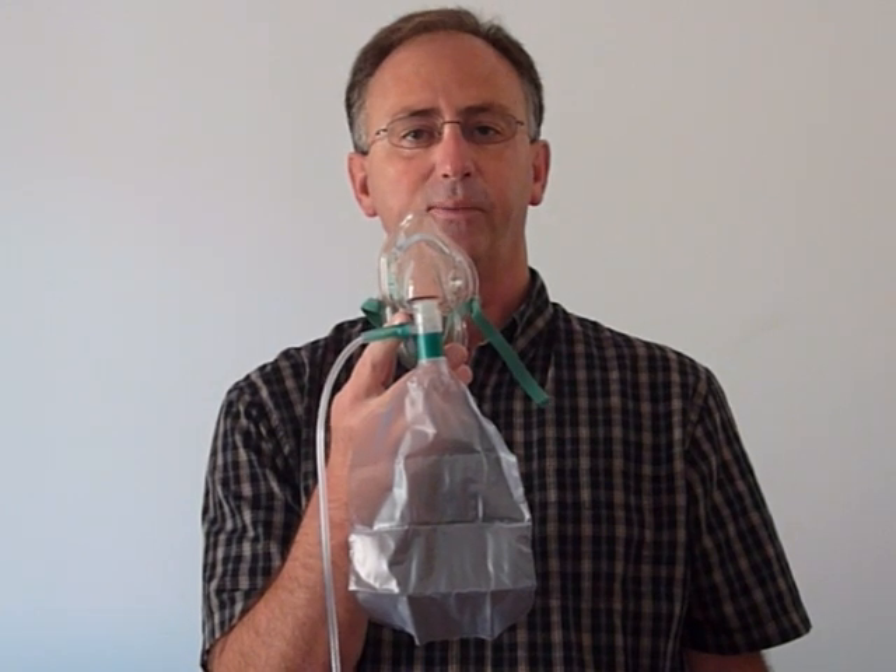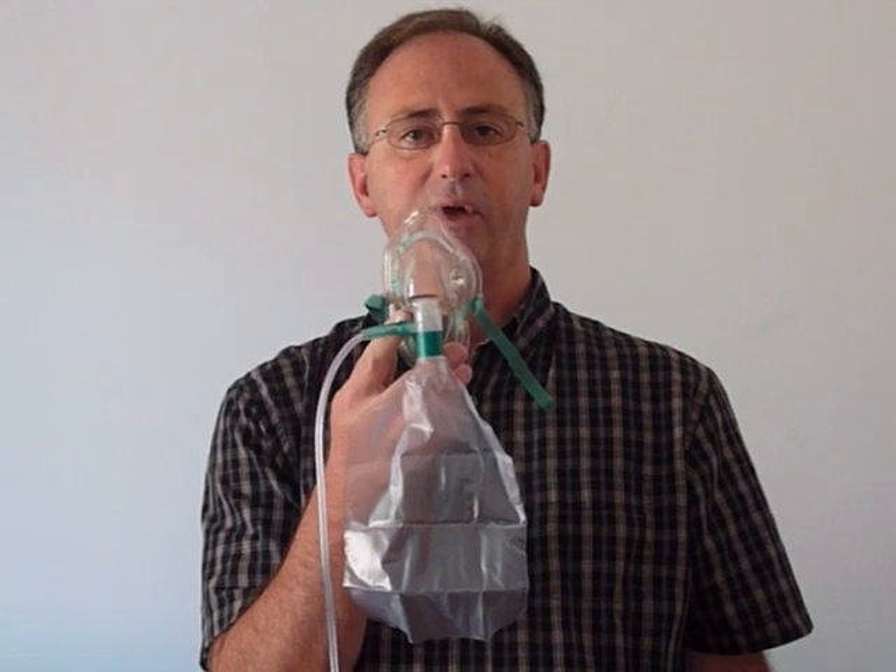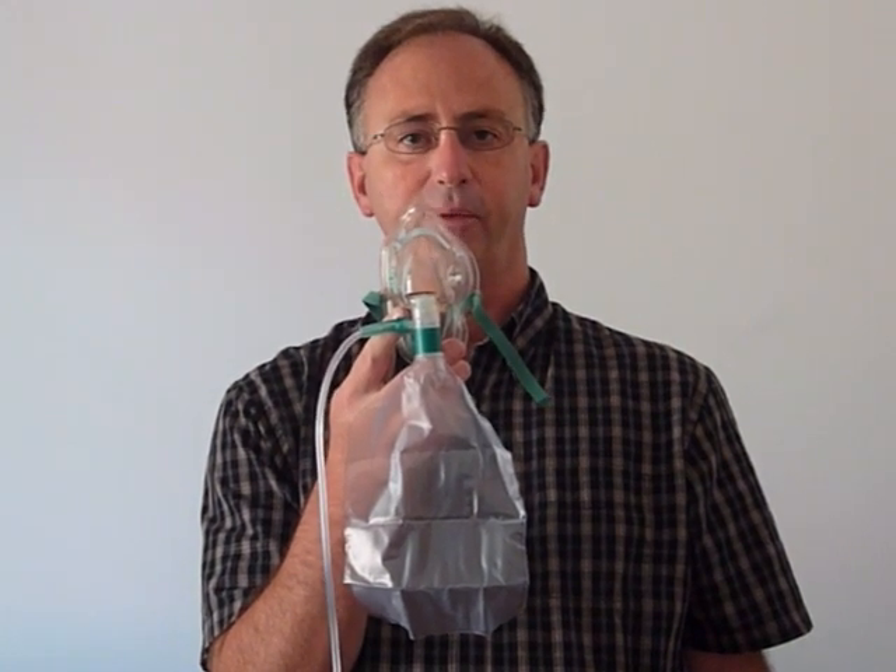This is an ideal mask for the EMS, fire, and emergency services market where you don't always have 100% oxygen availability.